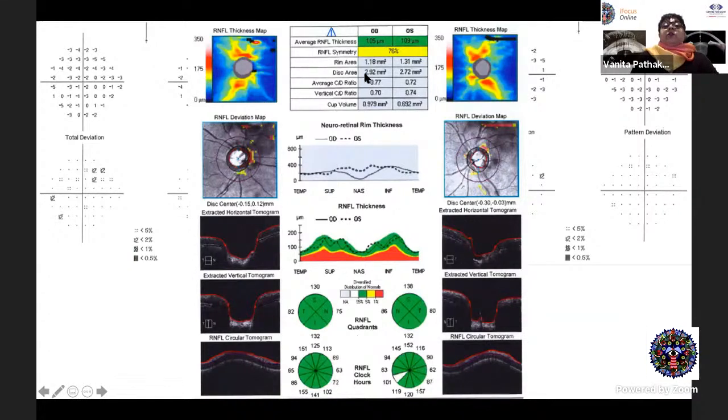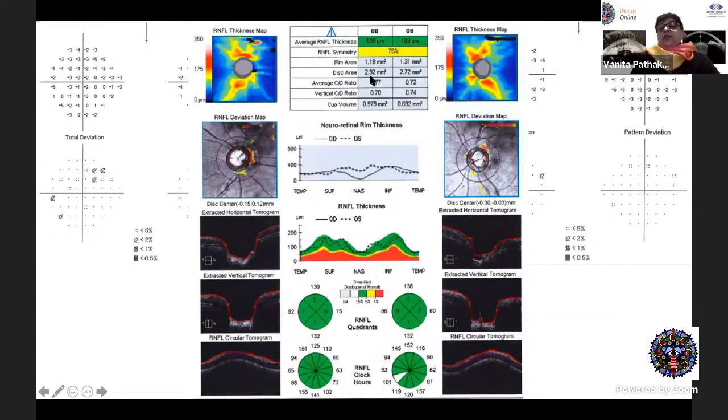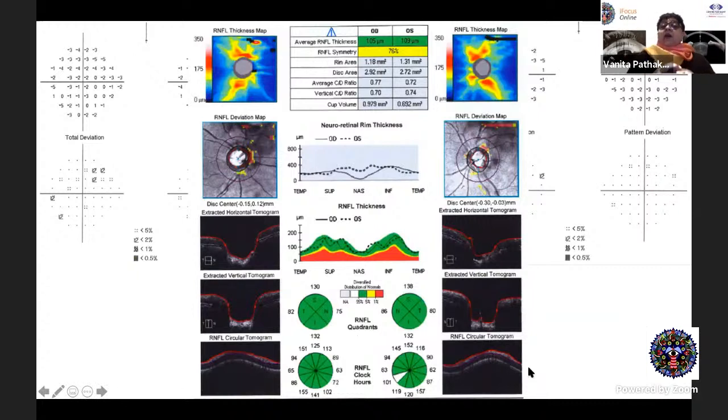Okay, the other point I wanted to make on the OCT is, what did we say clinically? Right was larger than the left. Yeah, so the OCT left is larger. No, this is the left, that's smaller. Oh, okay, slightly smaller than the right. Okay, so these are the points that you need to pick up. So you may be just shown this and asked, what is the visual field defect you're expecting? Okay, so it's your clinical conviction, which should say, and you deduce, that I'm not seeing any changes suggestive of glaucoma because of these points. So this is completely normal.